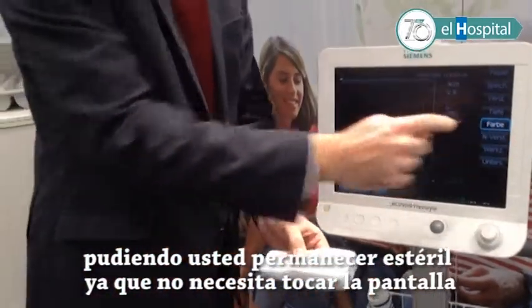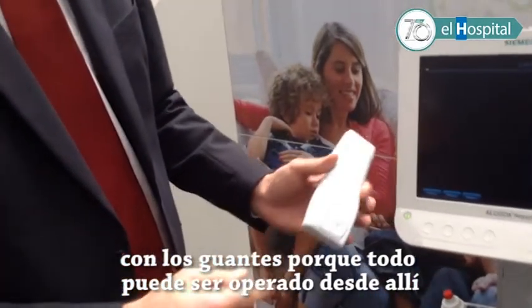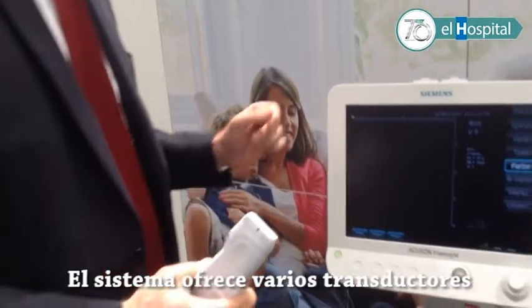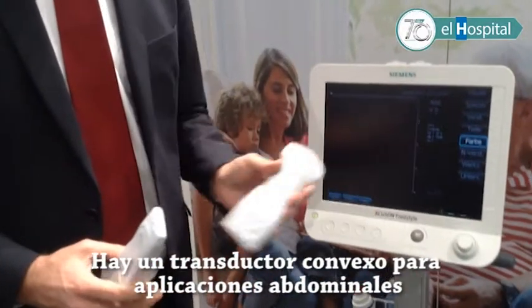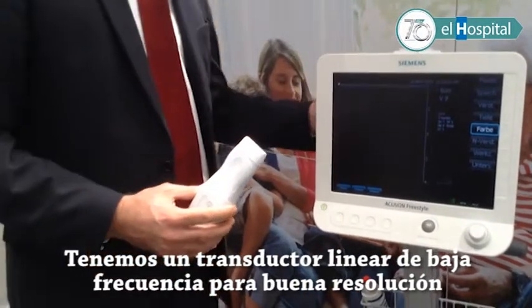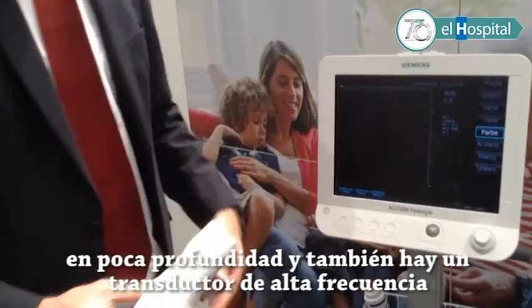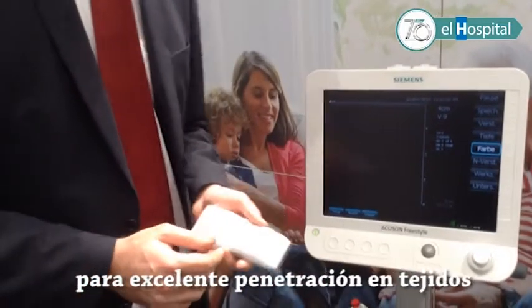The user doesn't need to touch non-sterile buttons because everything can be operated on the probe. The system offers various transducers: a convex transducer for abdominal applications, a low-frequency linear transducer for deep-lying structures, and a high-frequency transducer for excellent detail resolution.